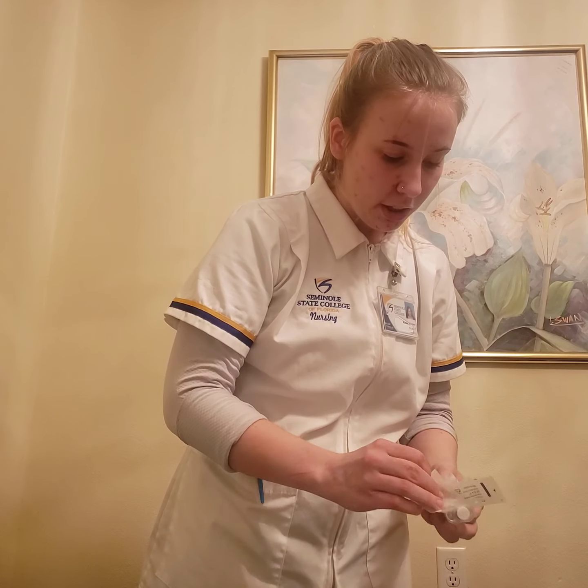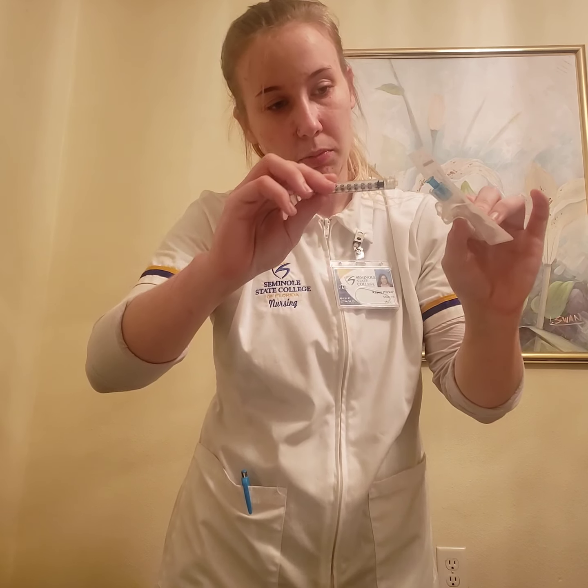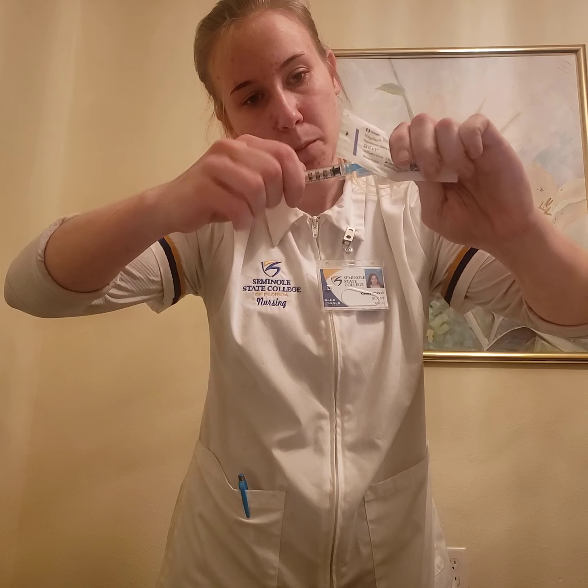I open these up here, and I need to make sure that the clean ends of the luer locks stay clean whenever I'm attaching them here. Okay.